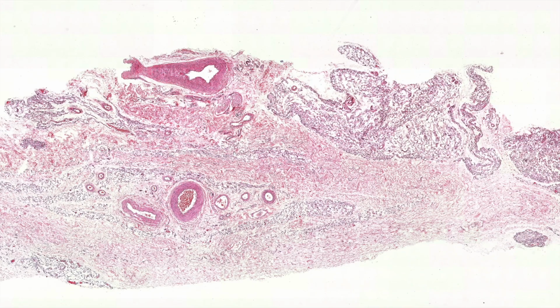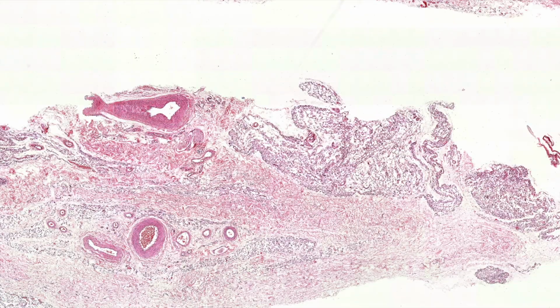Okay, so other lipoatrophy causes. Definitely steroid injection, trauma, right? Pressure from an adjacent mass. I see fat atrophy and muscle atrophy sometimes next to tumors, big soft tissue tumors that push and compress the fat. You can also get it from starvation or severe malnutrition, right? Those cases are really impressive, but thankfully we don't see them as often. Basically, the body just uses up all the fat and the cells are left as little husks, without their lipid inside. I don't know what the story was in this case as to why the atrophy happened, but it's a pretty good, impressive example.